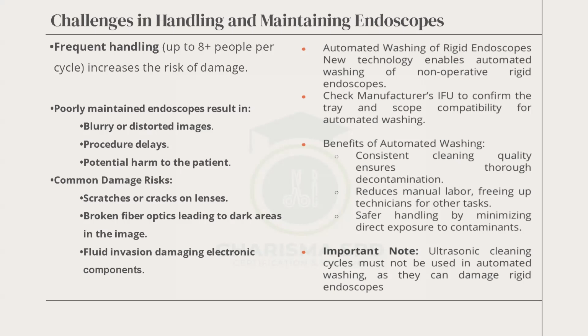Poorly maintained endoscopes result in blurry or distorted images. If you don't clean it well, it will come out with bioburden at the tip, and it will not be able to visualize or produce a quality image. It's like when your mirror is tinted with all manner of things, you can't see your face well.